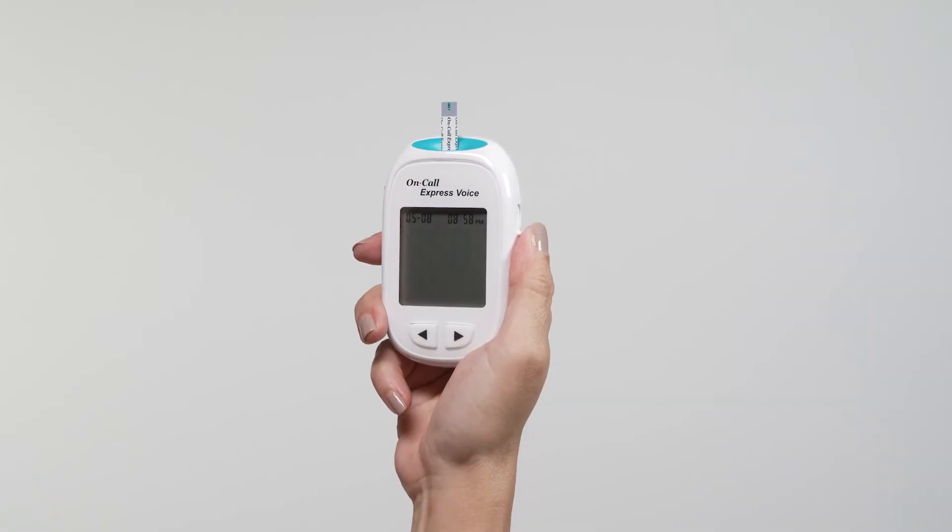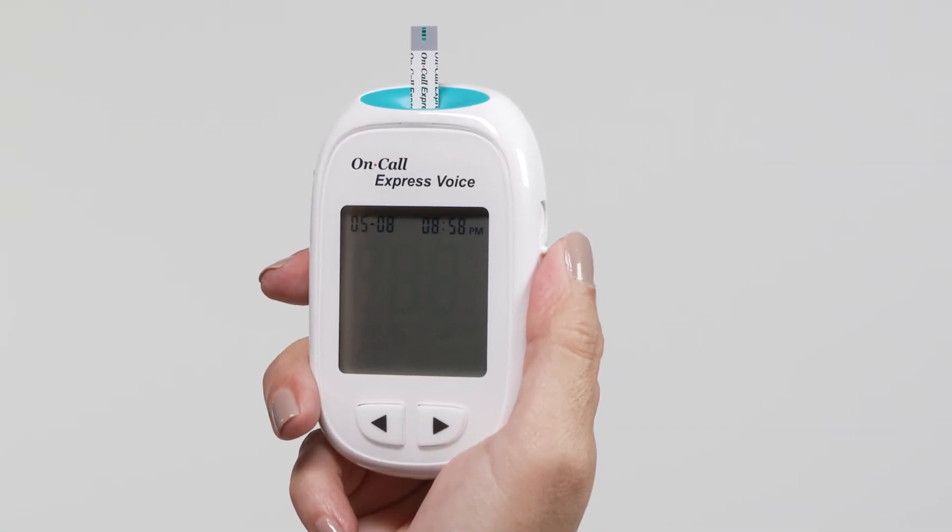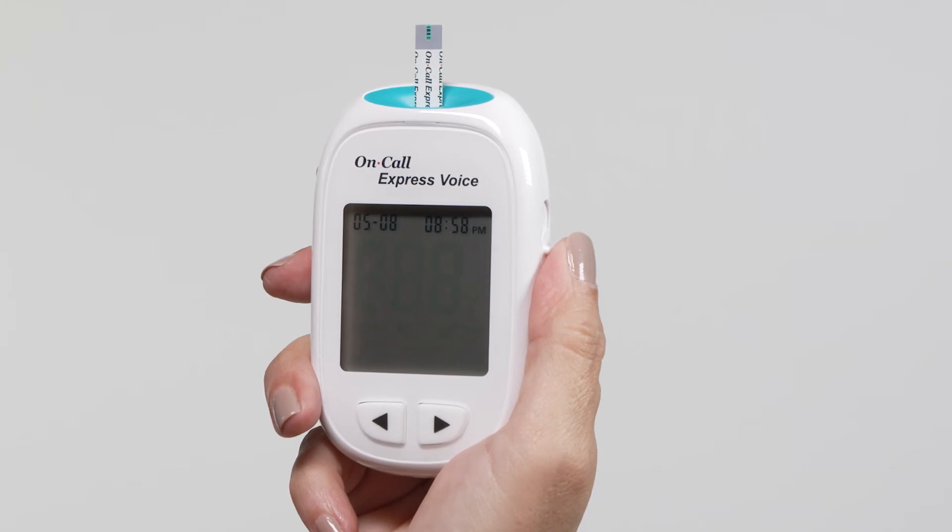Wait for the display to show the date and time in the strip icon with the blood sample icon blinking and say: Please apply blood to the test strip, to indicate that the test strip is inserted correctly and a drop of blood can be added.